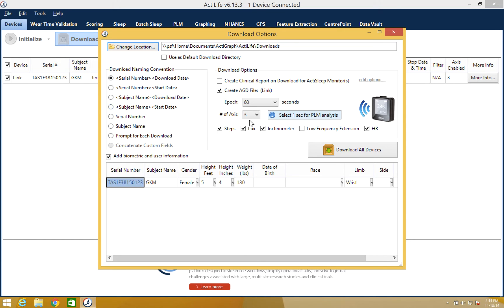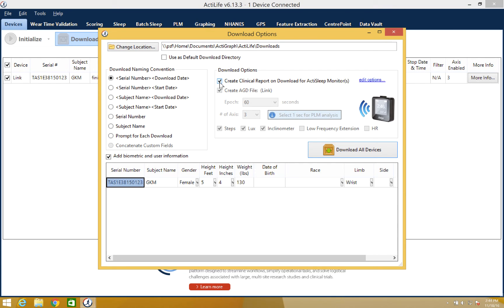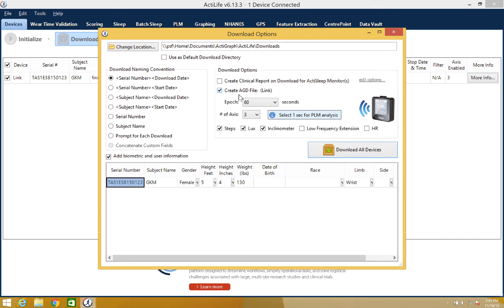The download options box will allow you to simultaneously create a clinical sleep report or an AGD file by checking the box to the left of these options. Please note that you can only create the clinical sleep report if you have the advanced sleep feature package. If an AGD file is selected, you will need to set the parameters for this file.